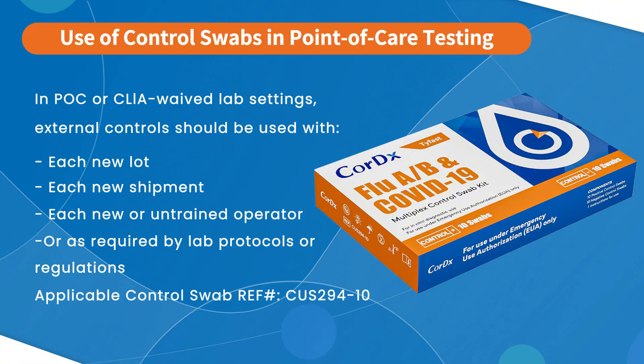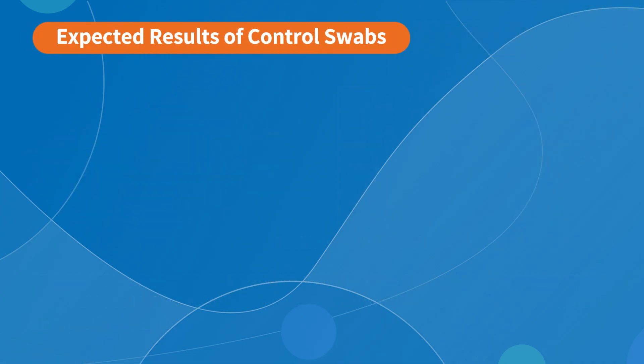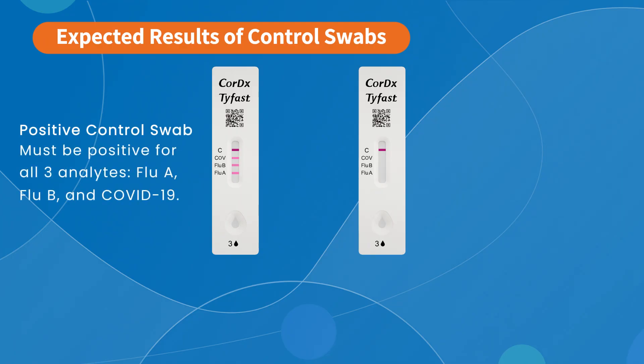The applicable external controls for the Cortex-TyFast Flu A, B, and COVID-19 Multiplex Rapid Test have the reference number CUS294-10. To perform a positive or negative control test, complete the steps in the Test Procedures section, treating the control swab in the same manner as a patient swab. The positive control swab test card must be positive for all three analytes — Flu A, Flu B, and COVID-19 — and you will see all four lines displayed on the test card.